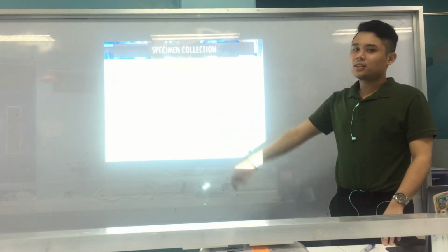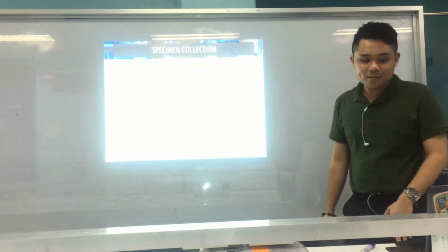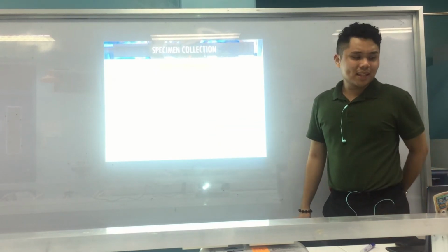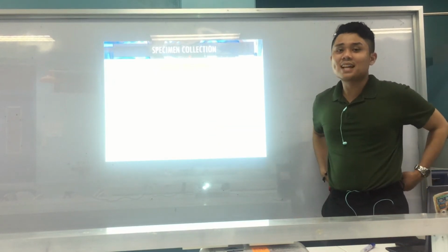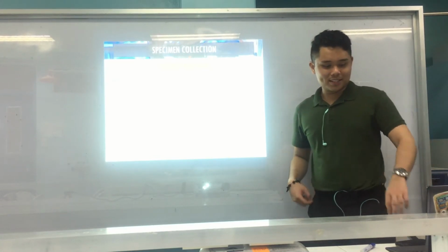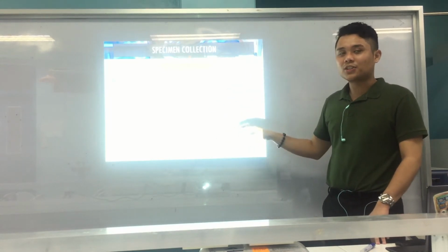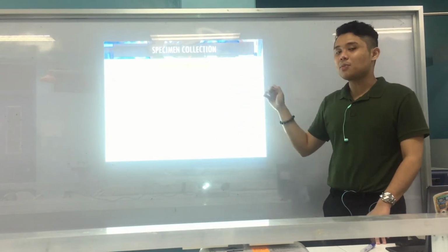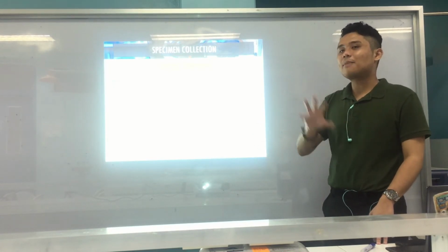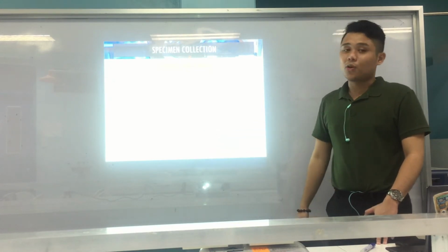Alright. And of course, label as always, right? Oh my God, you are almost in first sem, almost third year. When will this be emphasized? Yes, medtechs, of course, this should be repeated over and over. The label should be good. Alright. And of course, there should be the patient name and 2 identifiers. Usually, the name, the birthday, and hospital ID would suffice. But usually, name and birthday is okay, or age. And of course, the time and date of collection too.